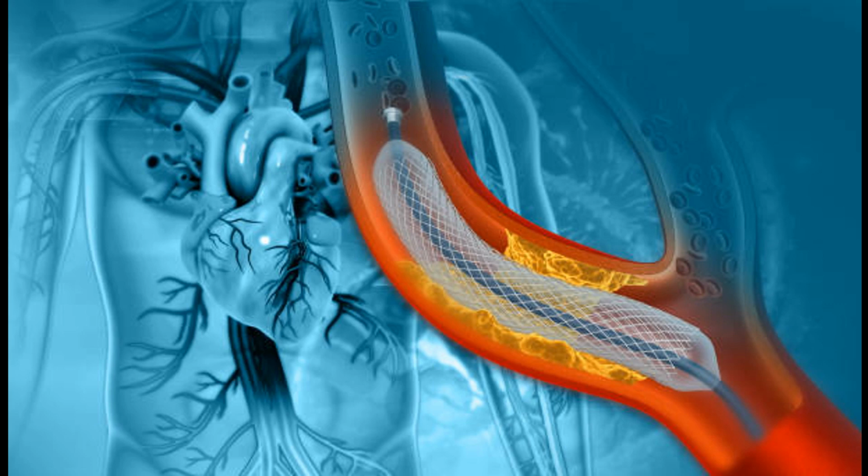Balloon catheter insertion. A balloon-tipped catheter is threaded over the guidewire to the location of the blockage. The balloon is positioned within the narrowed segment of the artery. Balloon inflation. The balloon is inflated, which compresses the plaque or fatty deposits against the artery walls. The inflation widens the artery, restoring blood flow.